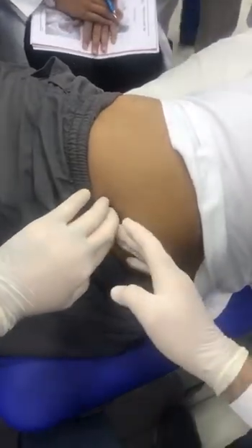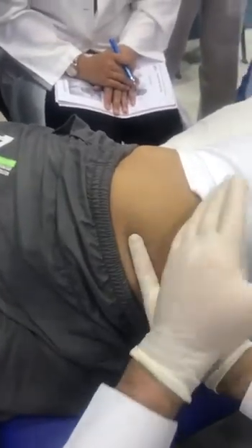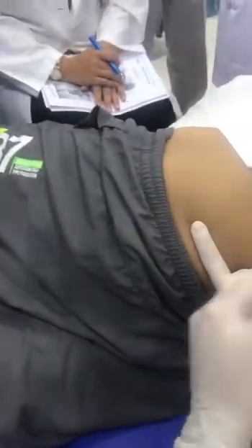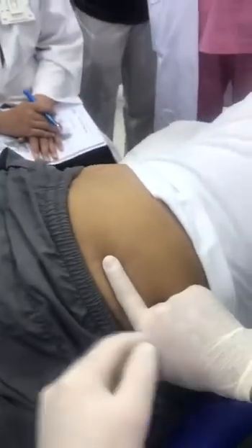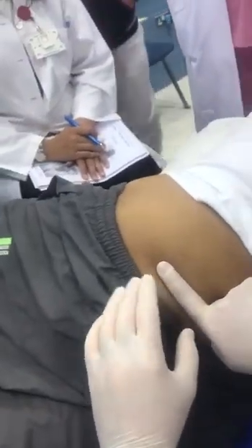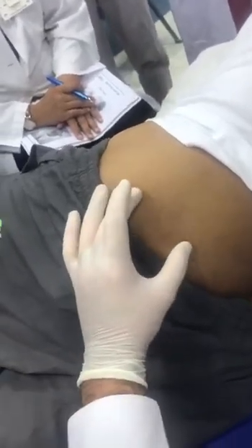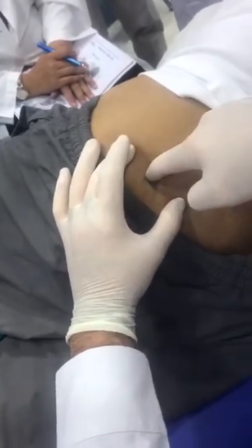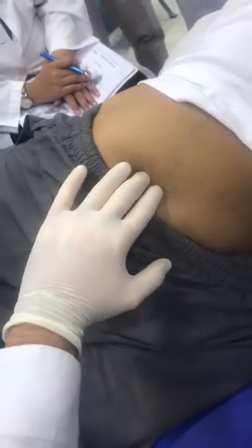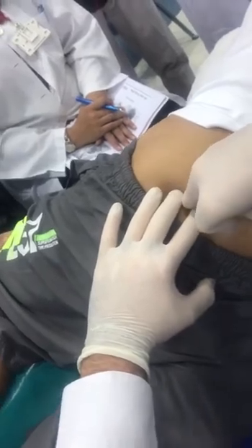So this was the line that we took as a reference for gluteus medius, and we say, don't ever go over this line, because especially in this midline we have a lot of risk to go through the sciatic nerve. Now we are going to consider that trigger points are going to be mainly in this mid part, so we are going to needle more or less in this direction. If we palpate indirectly the possible taut bands, we can be doing more or less in this direction.